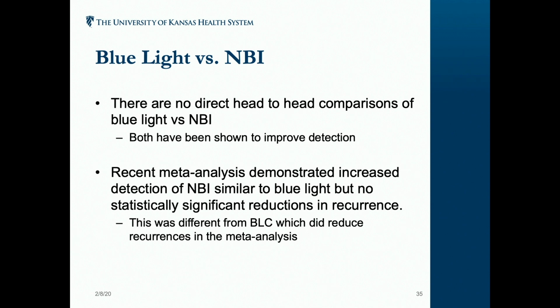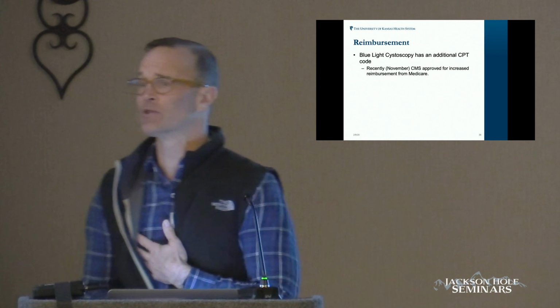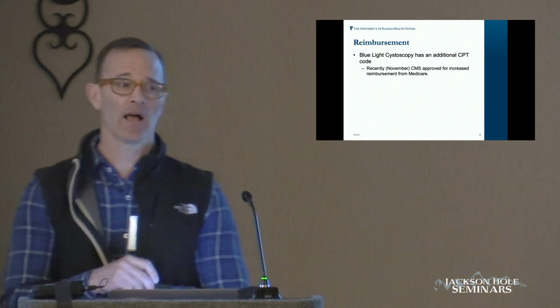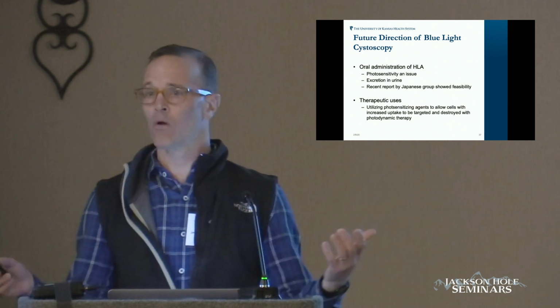Again, there are no direct head-to-head comparisons of NBI versus blue light, but there was a recent meta-analysis that demonstrated an increased rate of detection with NBI, but no reduced recurrences, and that's been shown maybe in a couple of studies. So again, I'm not here to bash NBI. I think it's fine, but it's probably not as effective as blue light. There is an additional CPT code for blue light that you can put in.